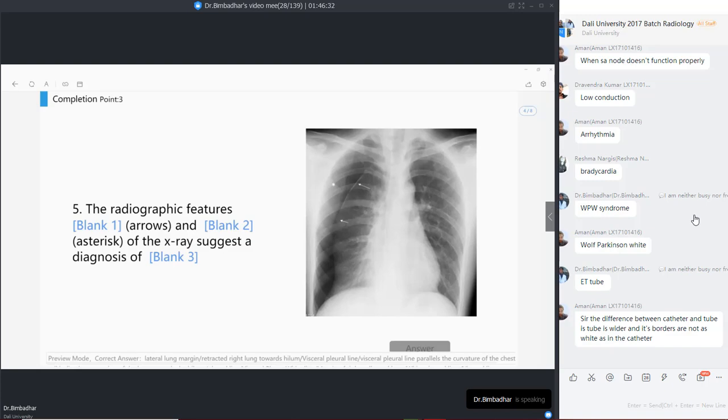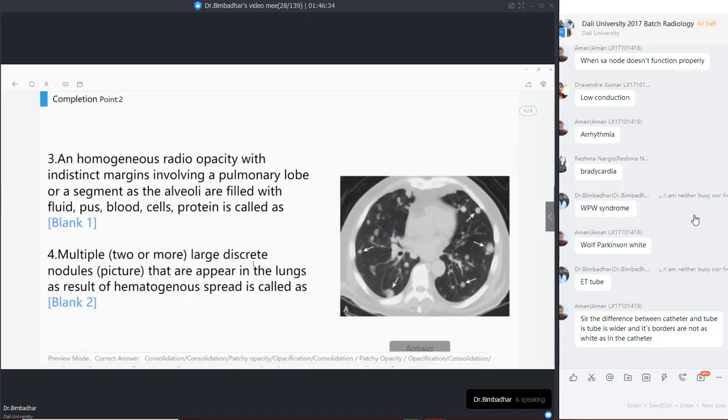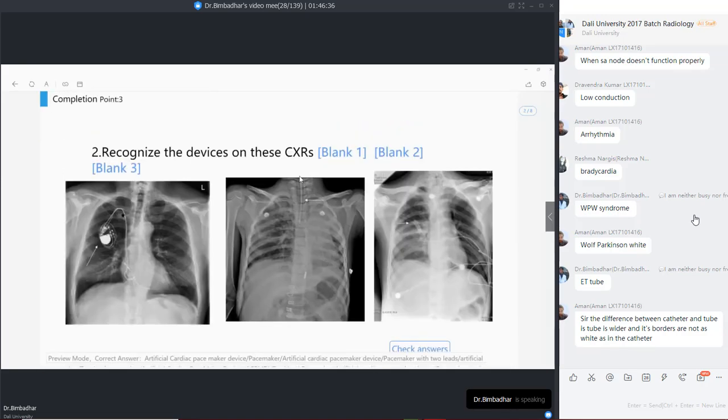How are we going to recognize it? We recognize it by the hyperdensity on only one side here. That is how we recognize it as a tube or a catheter. This is also a tube, but you see here both of the ends are hyperdense, which means I'm looking at a plastic tube placed inside the hemithorax. Okay, right?